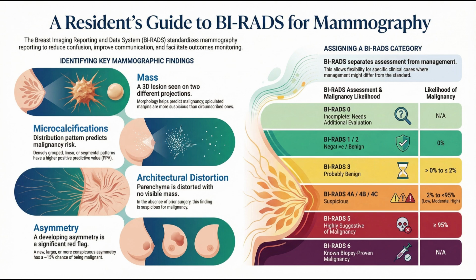You know, if you've ever stared at a medical report and just wished you had a secret decoder ring, this deep dive is for you. Today, we are cracking the code on one of the most critical languages in medicine. We're talking about the lexicon radiologists use for mammography reports. The Breast Imaging Reporting and Data System, or BI-RADS.